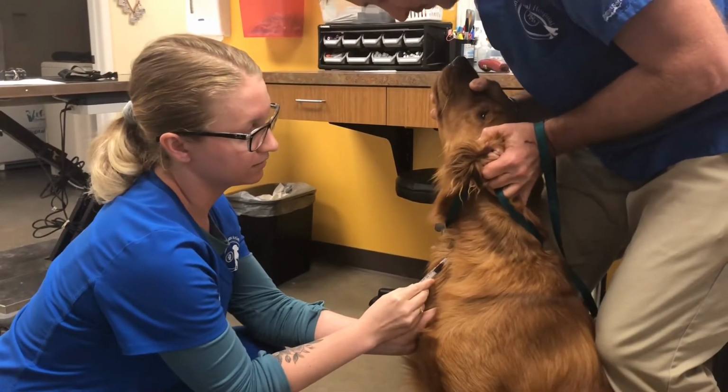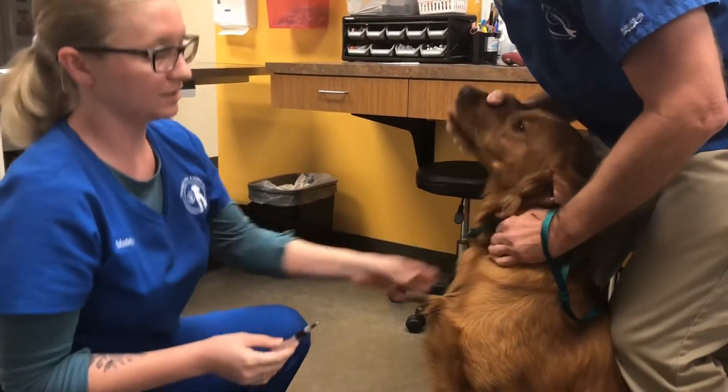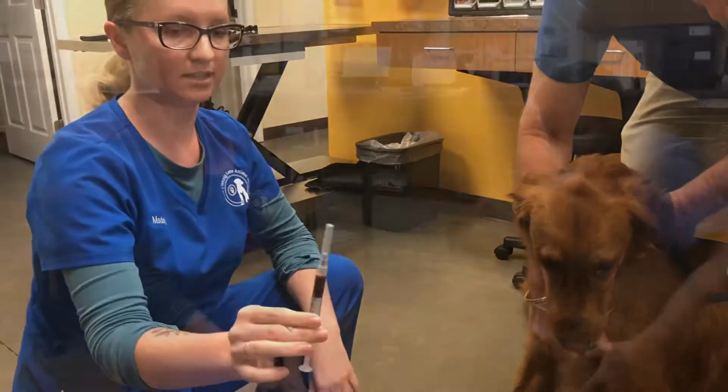It's okay, buddy. Pull back. Then I'll have my restrainer hold off so he doesn't develop a hematoma. Oops. Recap my needle, and that's the blood sample.